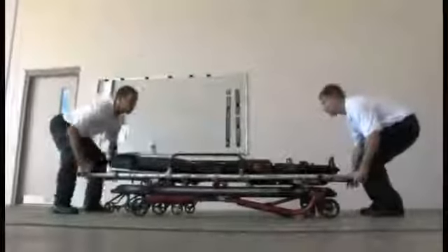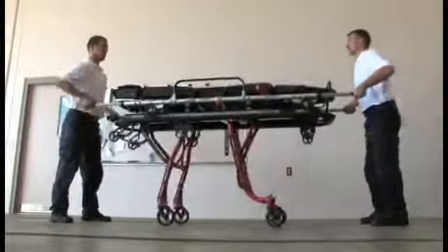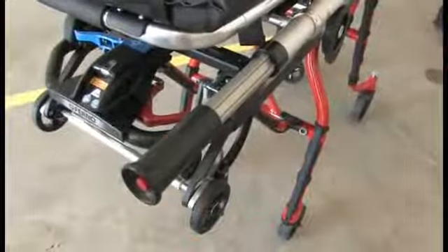For added convenience, the lift bars in the stretcher may be extended. To extend the lift bars, press the button on the end of the handle and pull the handles out. Reverse this to push them in.